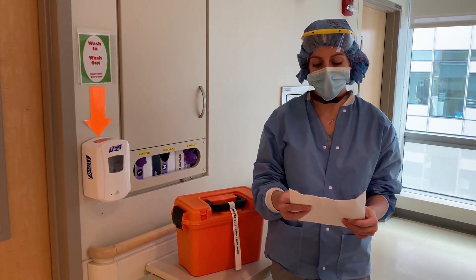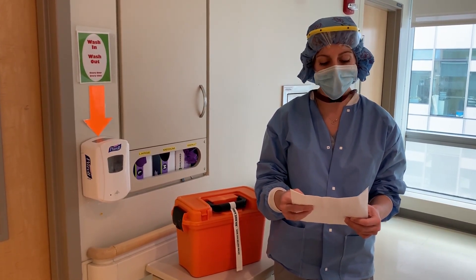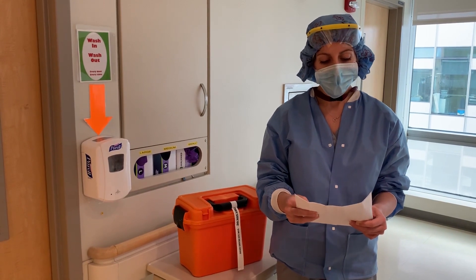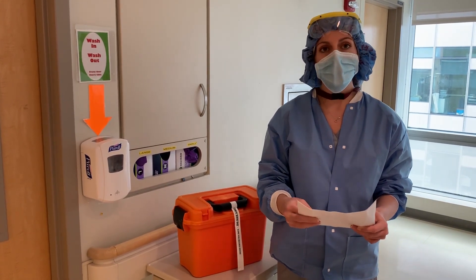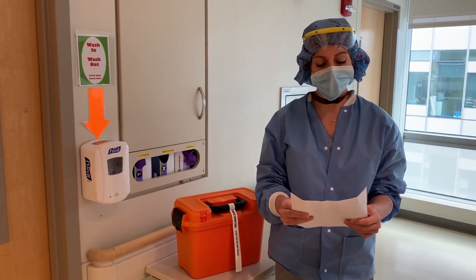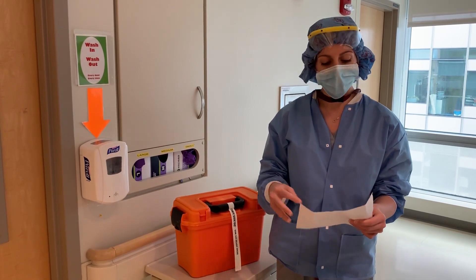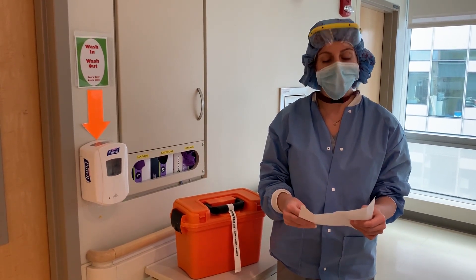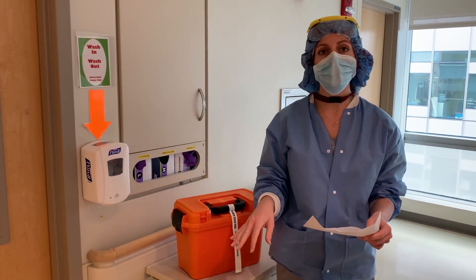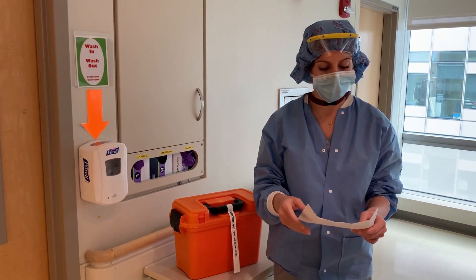The team should minimize proximity to the patient and remain over six feet away whenever possible. The core team in the room will be an attending anesthesiologist, a respiratory therapist, and an ICU nurse. There will also be a respiratory therapist outside of the room as well.